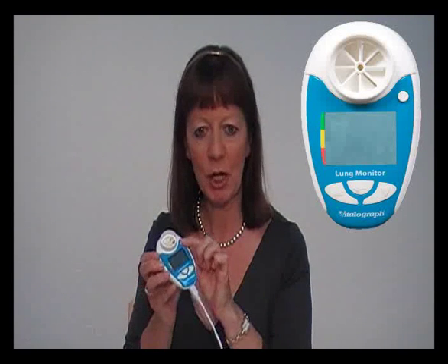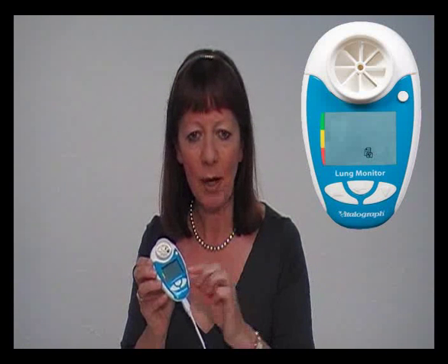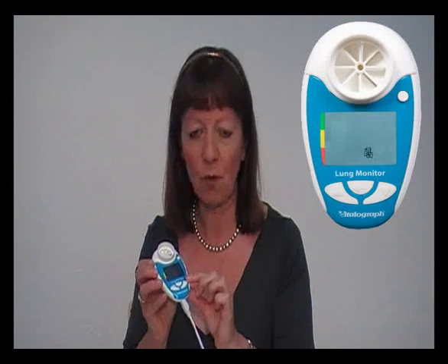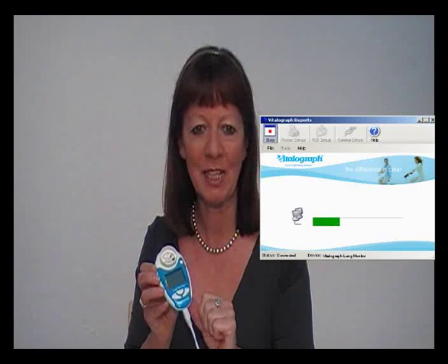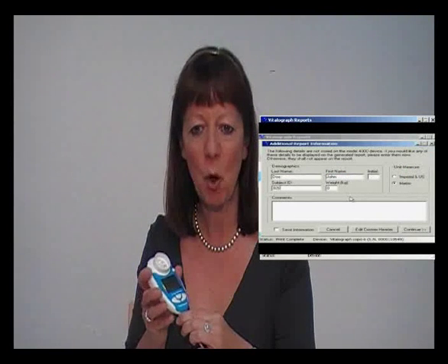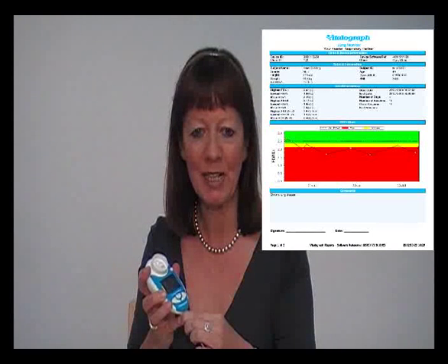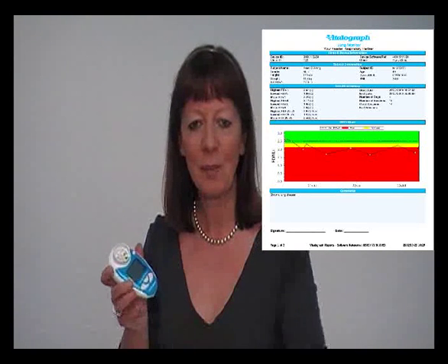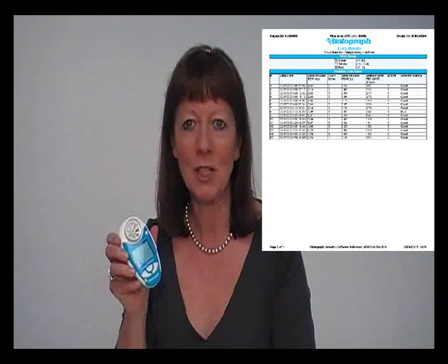Using the circular button, switch the Lung Monitor on and scroll down to the transmit icon. With this icon showing and the Vitalograph reports software running on your PC, press the enter button on the unit and the test results will automatically transmit. You will be given the facility to fill in subject demographics and comments on the PC. A colourful PDF report document will be generated, which can be stored with the subject record or emailed to other healthcare professionals for comment or discussion.